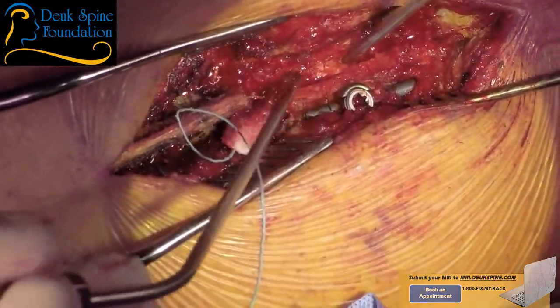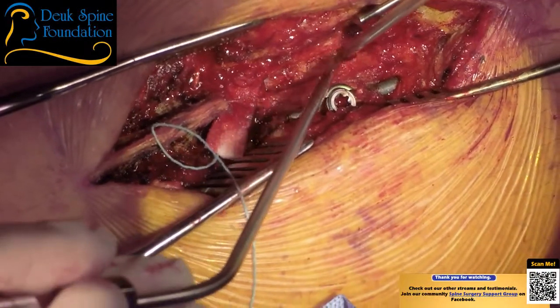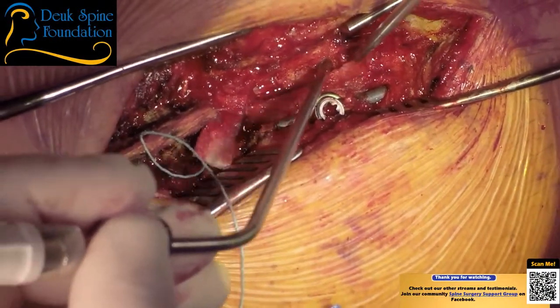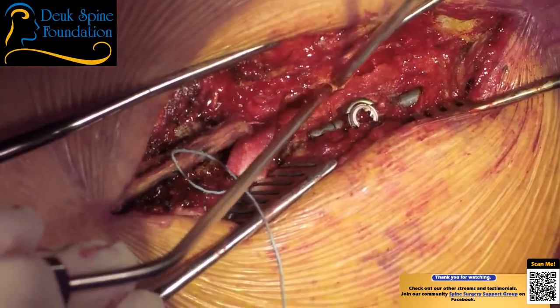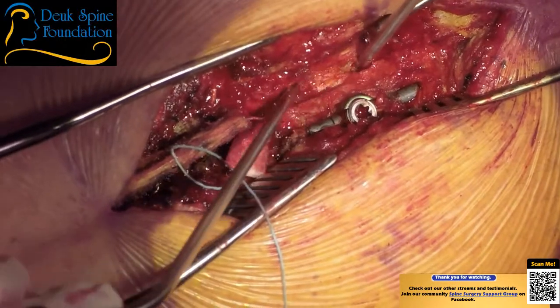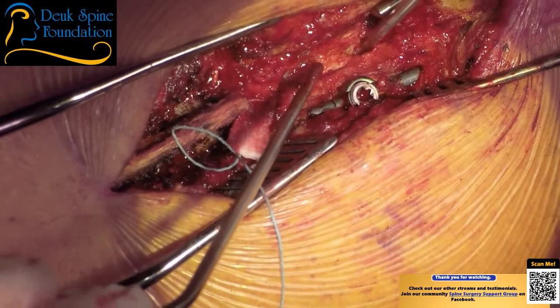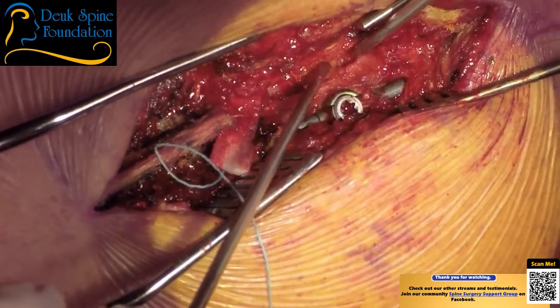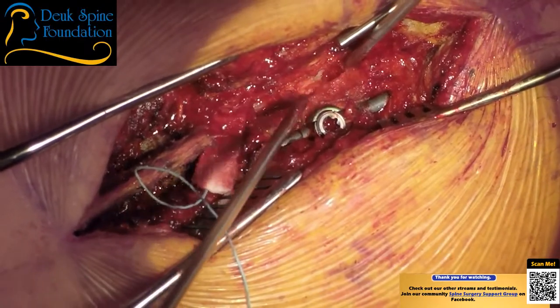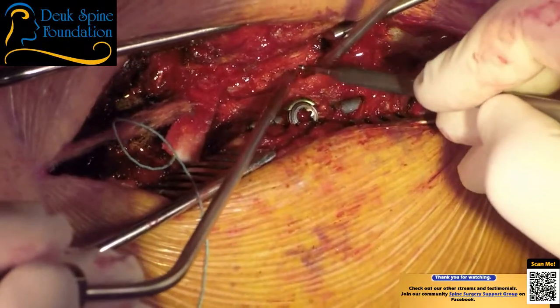There's some serious crushing going on, though. You can't really appreciate it from where you are, but that's a spinal cord. And then way down here is where the lamina is. So it's like digging in. This is the last part that we need to unpinch. I'm just studying the anatomy carefully before I start working. I want to make sure I understand it. Really want to come from down there, so I'm going to try one last time right here.